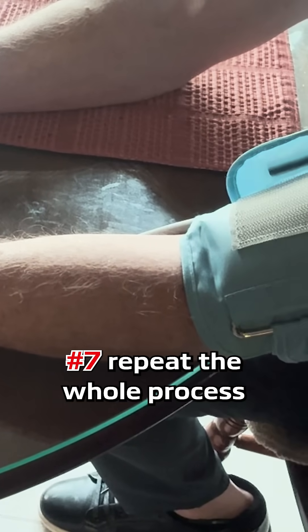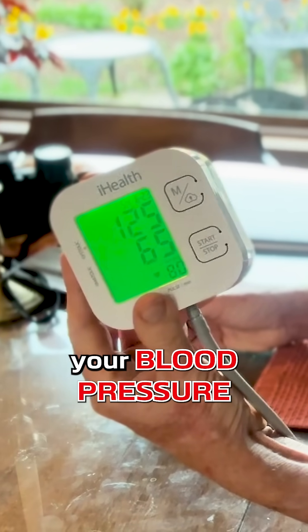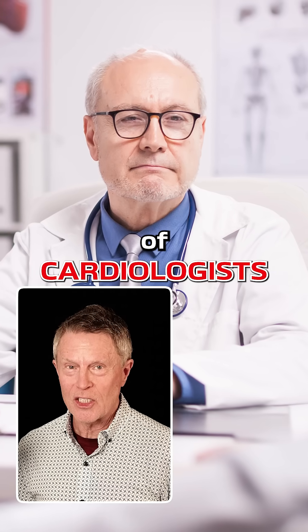Number seven, repeat the whole process in your other arm for more accuracy. Now you know how to measure your blood pressure even better than 80% of cardiologists.